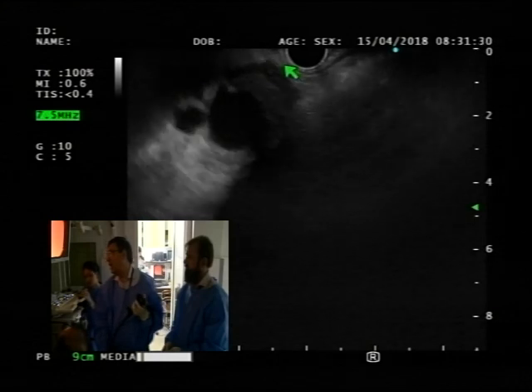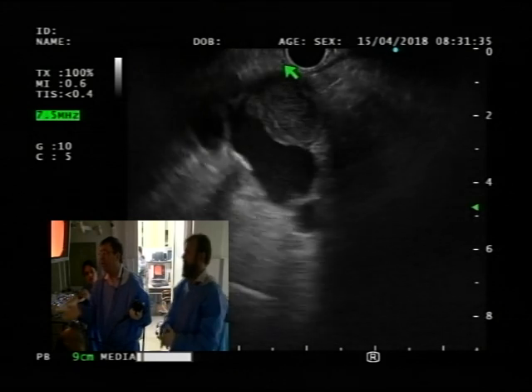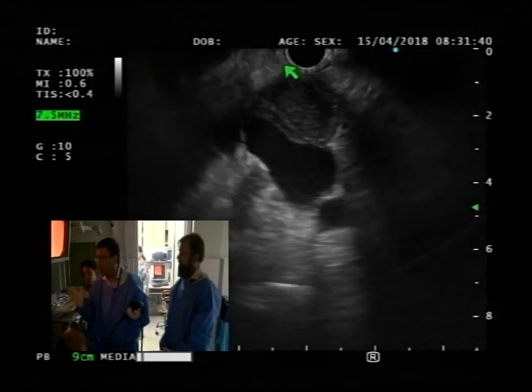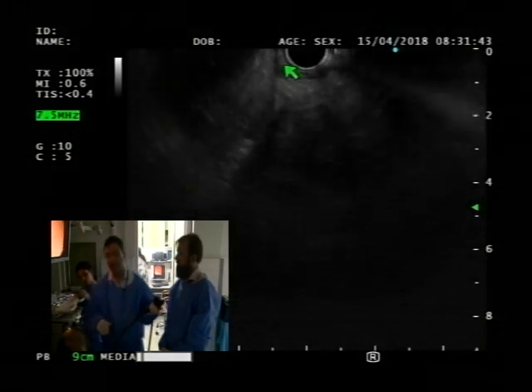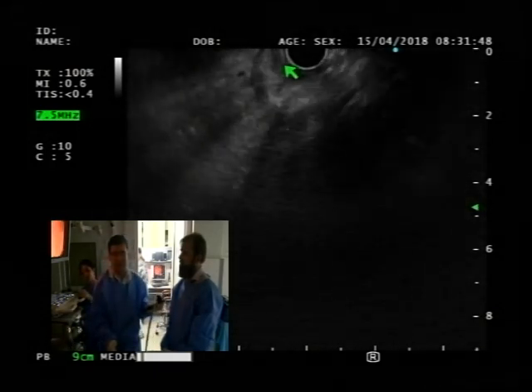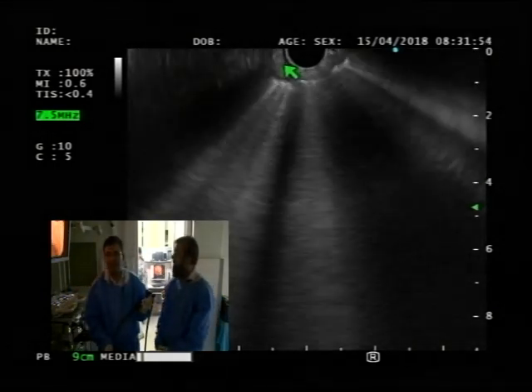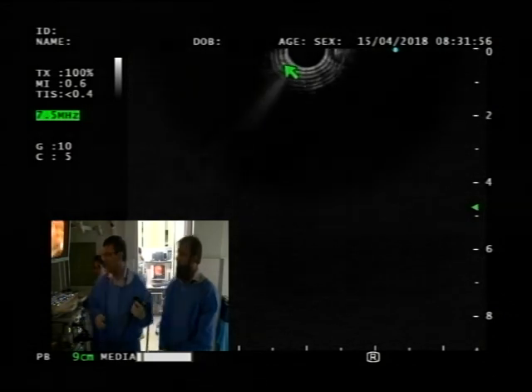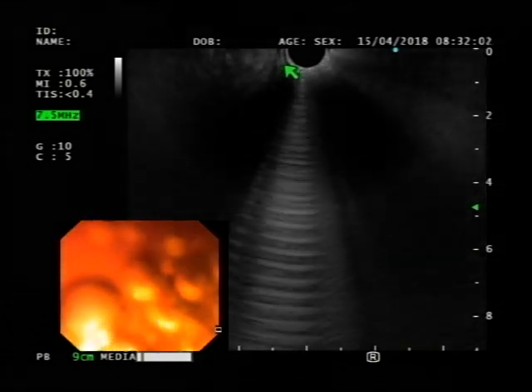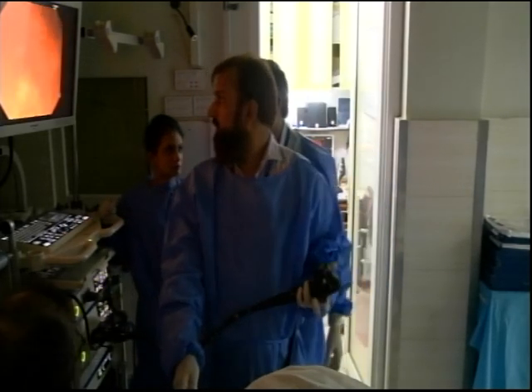Okay, clinically, the way it looks to me is chronic pancreatitis as a risk of leading to splenic and portal vein thrombosis, leading eventually to varices. I don't know if she has any symptoms suggestive of malignancy. Anybody knows about that? She's just complaining of pain. Yeah, that's a problem. Okay, should we stop, or do we need any more demonstration?